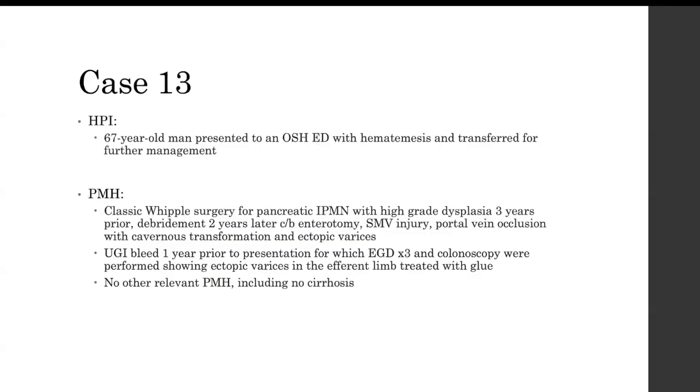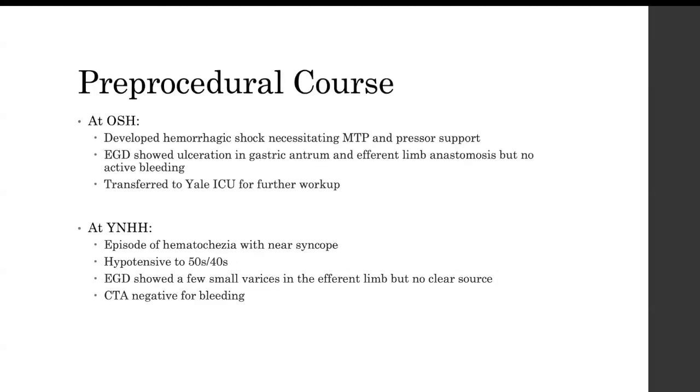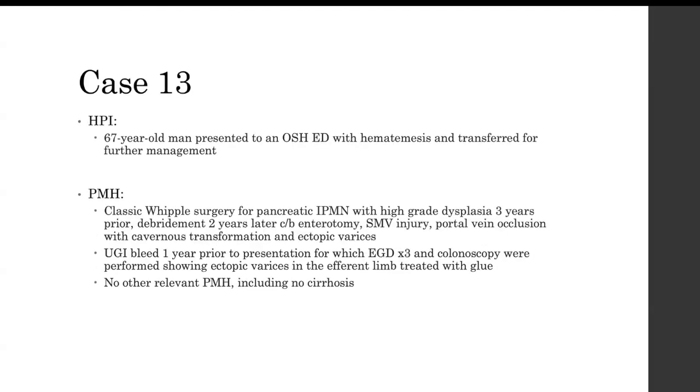All right. So this is the last case, which is good because once again, I'm using all the time. This is a lengthy case. I actually published it, but this is to illustrate what else can you do if a patient has variceal bleeding, but you can't place the TIPS. So I'll just tell you, this is a guy, 67.